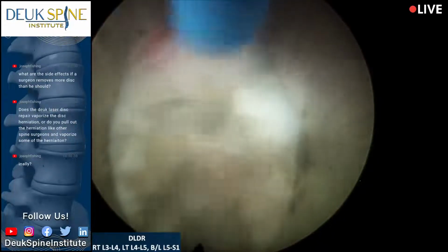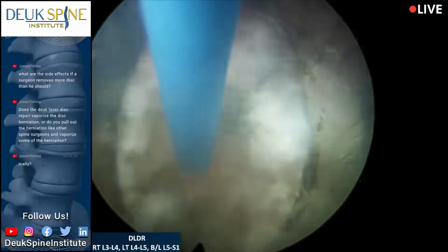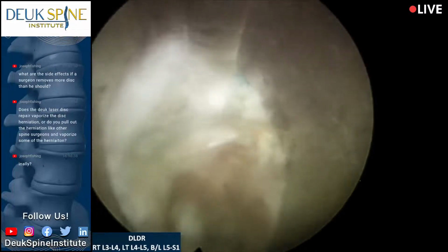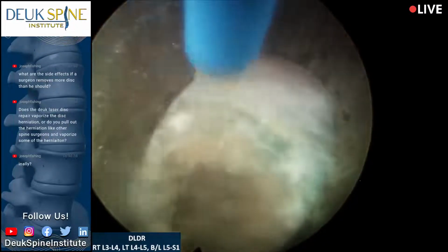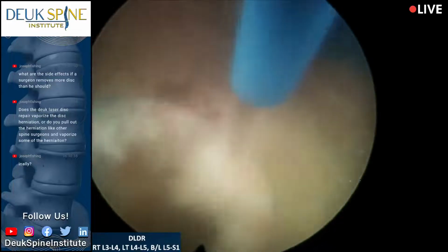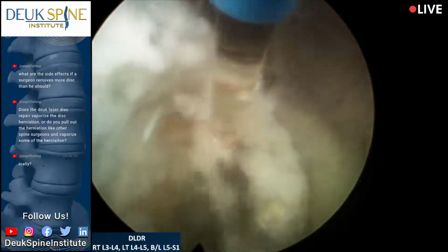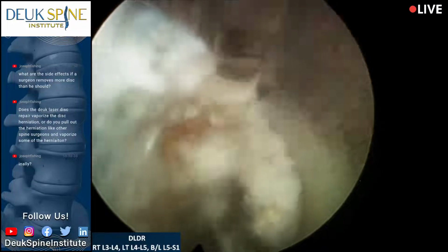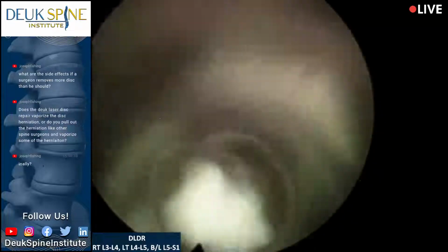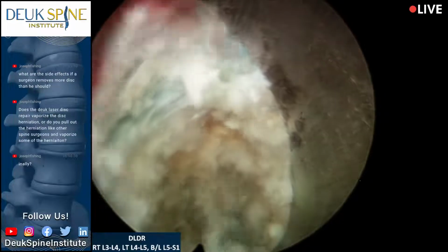Good question. All right, we are at the end of the annular tear, and I've gotten rid of the herniation. I've gotten rid of the nasty scarred up annulus. And what amazes me here, to be honest, is this disc actually looks pretty good. It's pretty well preserved. It's not so degenerated. I've seen far worse, far more degenerated discs. So, given her age, this is a pretty good one. I'm sure we're going to see a more degenerated one soon, but for right now, I'm pretty happy with this. It's looking good.